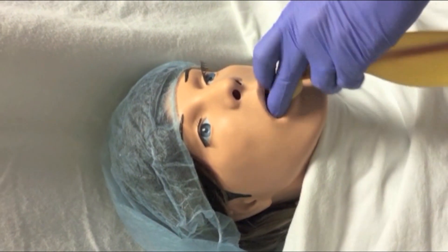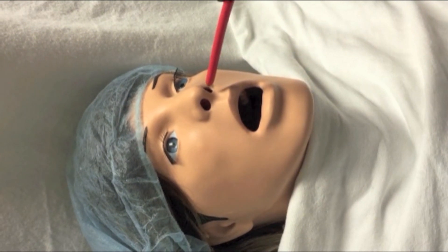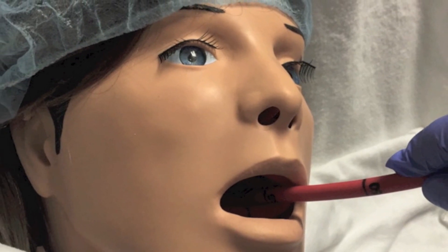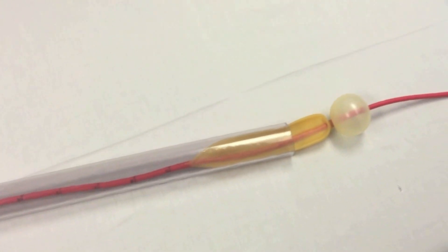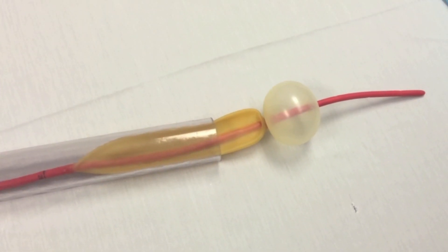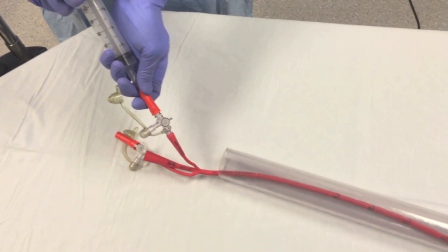Pass the Blakemore tube through the mouth, which is preferred, or the nostril. Once at around the 45–50cm mark, the tip of the tube should be in the stomach. To verify proper placement, air can be injected through the gastric aspiration port — not the balloon port — while auscultation is performed over the stomach, and gastric contents can be suctioned to verify proper placement. Proper placement may also be verified by an x-ray.